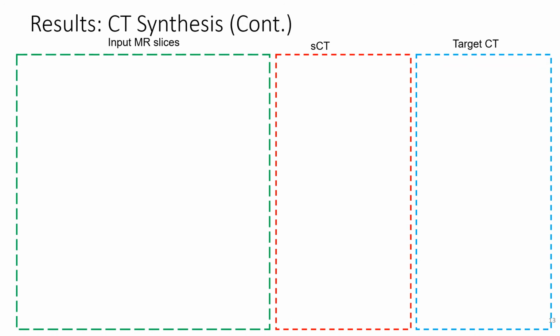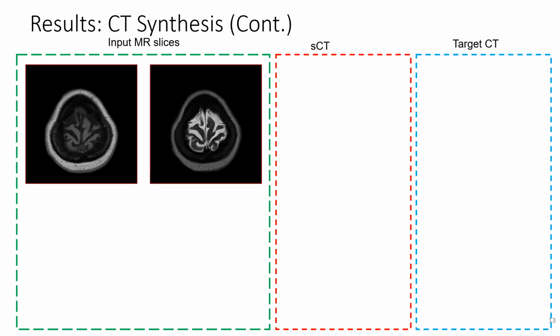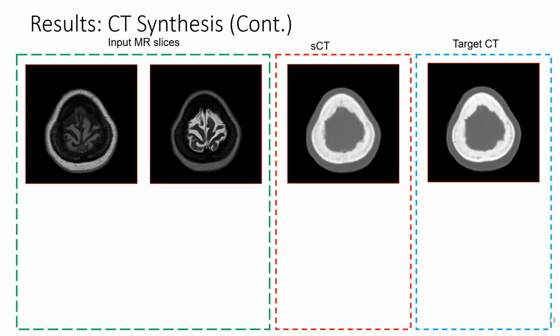In the beginning of the presentation, we mentioned that it's important to estimate the inner layer of the skull to improve the generated volume mask. So we showed two cases pertaining to the top and to the base of the cranium. In the first case, we show you the top of the cranium. As you can see, this is the generated and this is the CT.